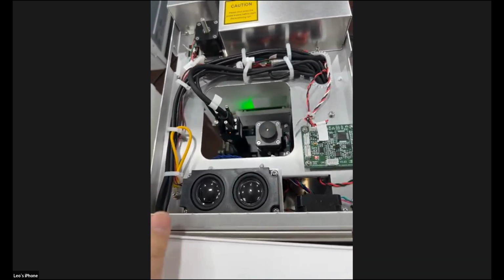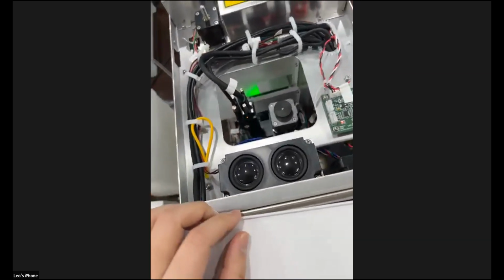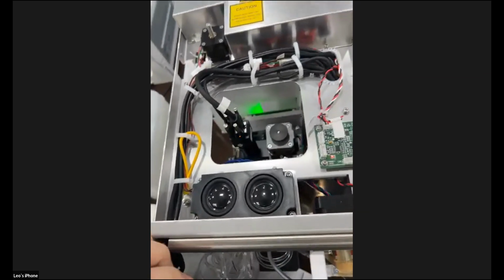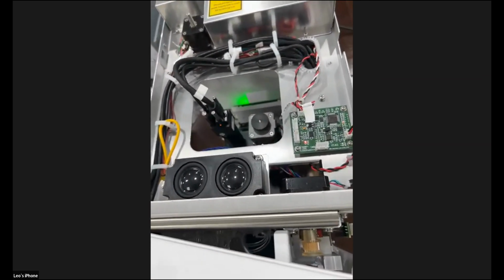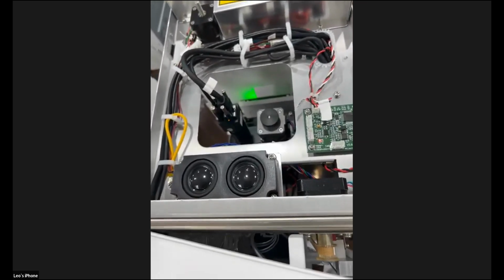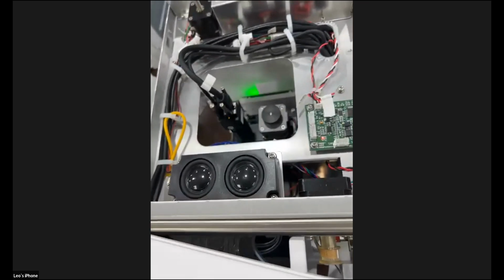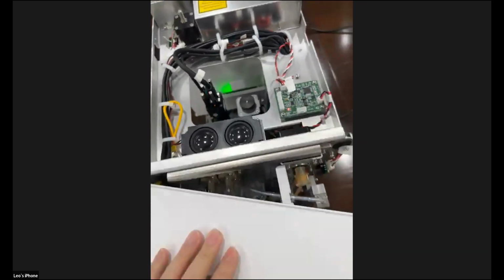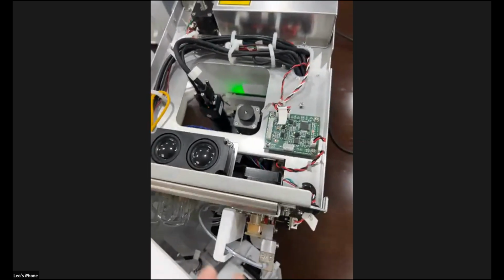It's not only result alarms referring to disease, but also system alarms, like the fluid circuit needing maintenance, or other alarms like this. All of that will be spoken from here.